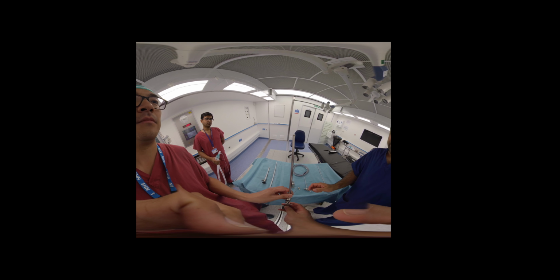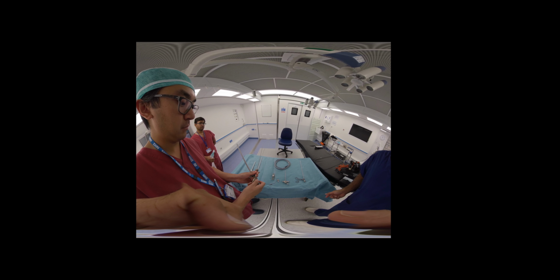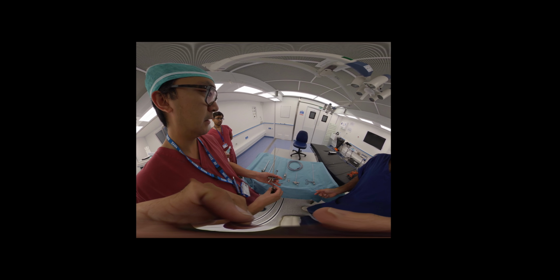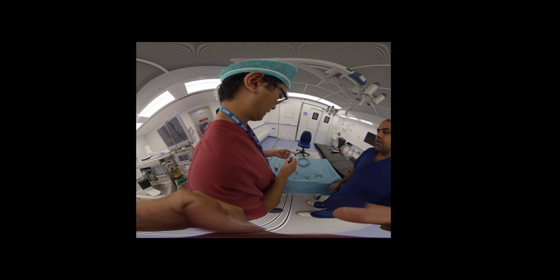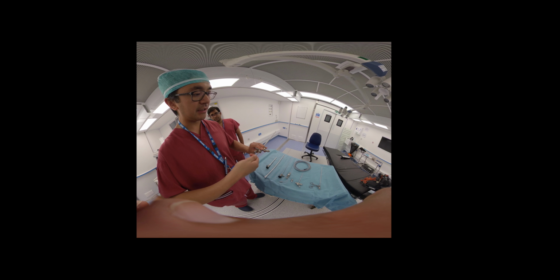So now if we take the bridge off, and we reinsert our light down there, then it will go beyond the end of the bronchoscope. So it's there for safety, so that you're not going to damage anything further on, and you can have a much better understanding of the depth. So to assemble the bronchoscope, you attach the bridge, tab facing downwards, and it just clicks into place.